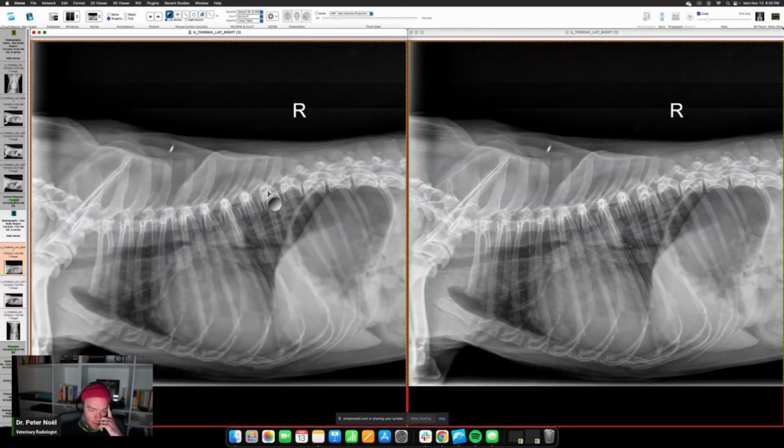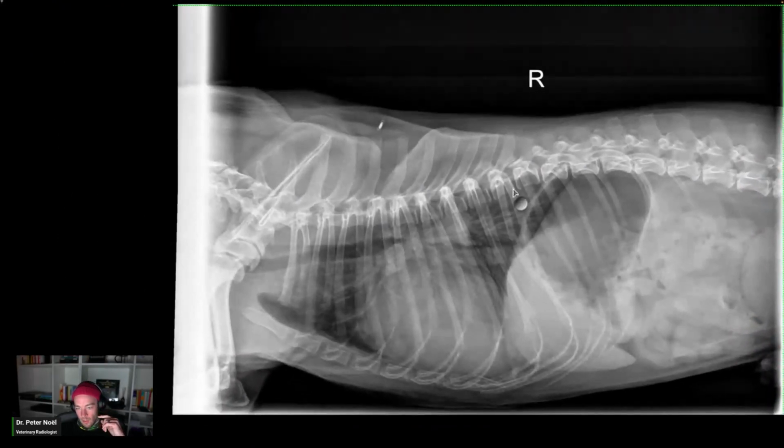Let's just talk about the cardiac silhouette, okay? Nine times out of 10, you could put up the study, not look at it, close your eyes, and say the dog probably does not have pericardial effusion and probably does not have right-sided cardiomegaly. They're just not that common. We read thousands of radiographs every year, and so infrequently do I get confirmation from echoes or histories suggestive of pulmonary hypertension from pulmonary fibrosis or heartworm disease, or other things like that. So usually it's a left-sided problem, okay? So what you could do is back into the left side by confirming the probability that right-sided cardiac disease and pericardial effusion are less likely.